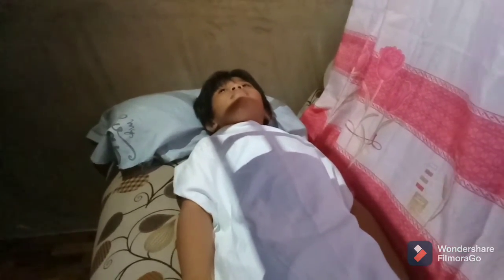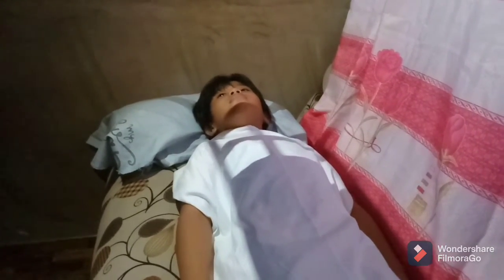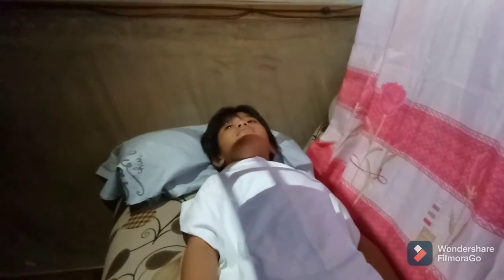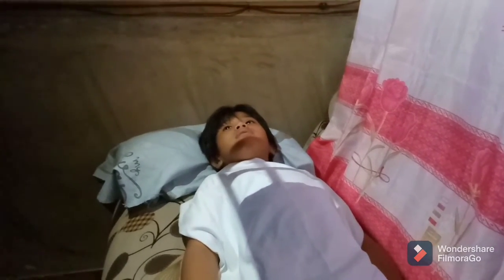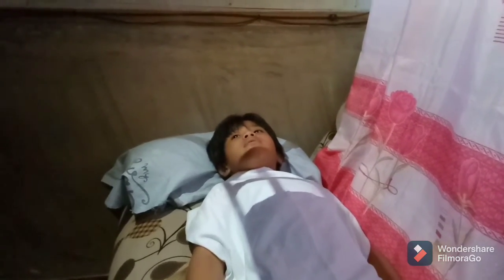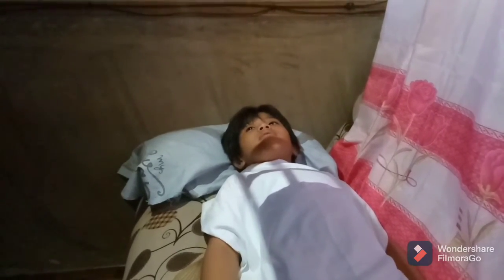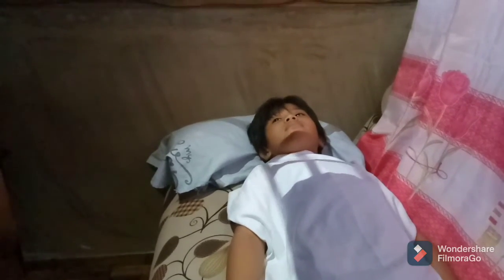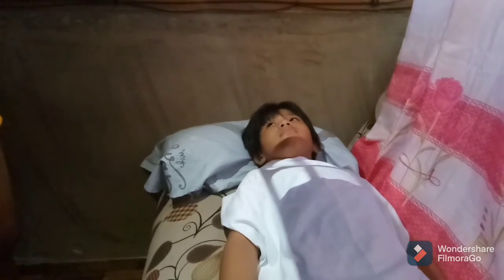In patient positioning, position the patient supine on the cart. If possible, the head end of the cart or bed should be raised into a semi-erect position. Roll the patient's shoulders forward by rotating the arms medially or internally. In part position, place the IR behind the patient, then align the center of the IR to the central ray, with the IR about 1 1/2 inches or 4 to 5 centimeters above the shoulders. Then center the patient to the CR and IR and check by viewing the patient from the top near the tube position.